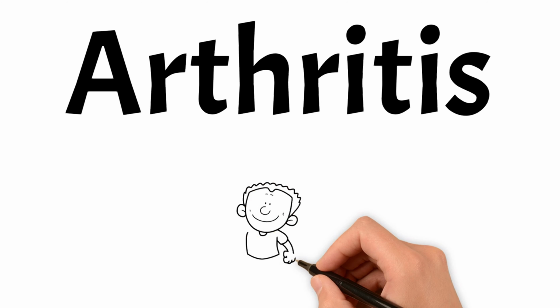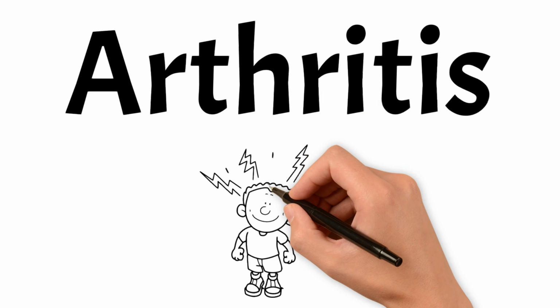Today we will be talking about arthritis. We will be looking at two common types that you may see in practice, and hopefully by the end of this video you'll be able to easily distinguish between these two arthritic types.